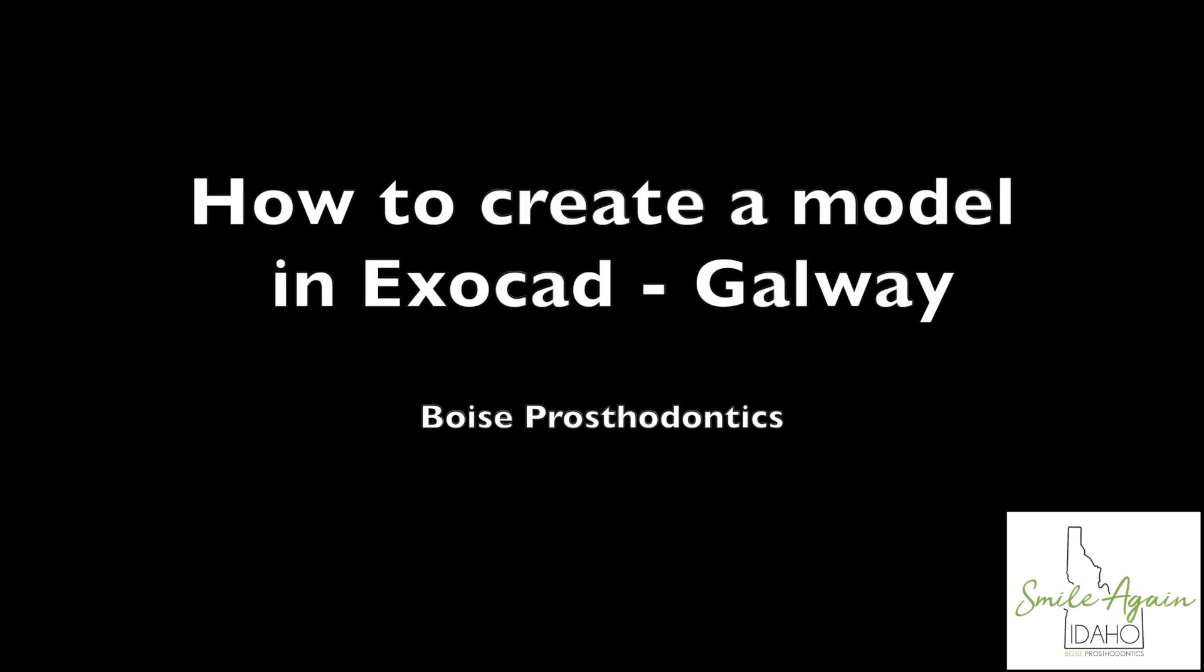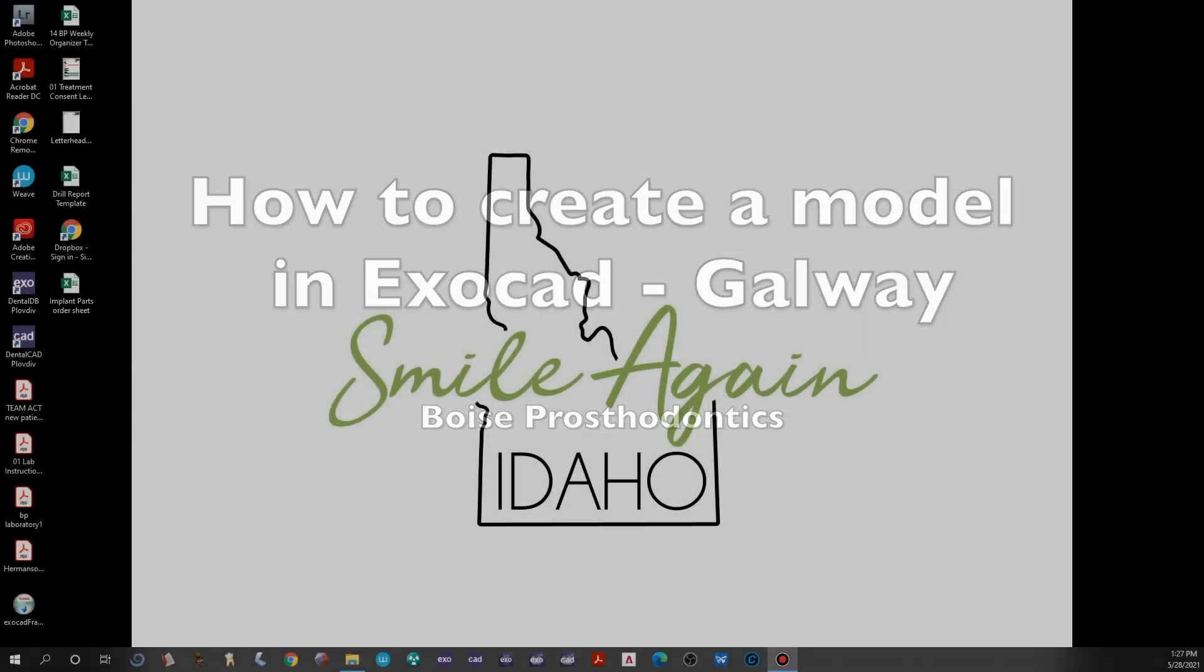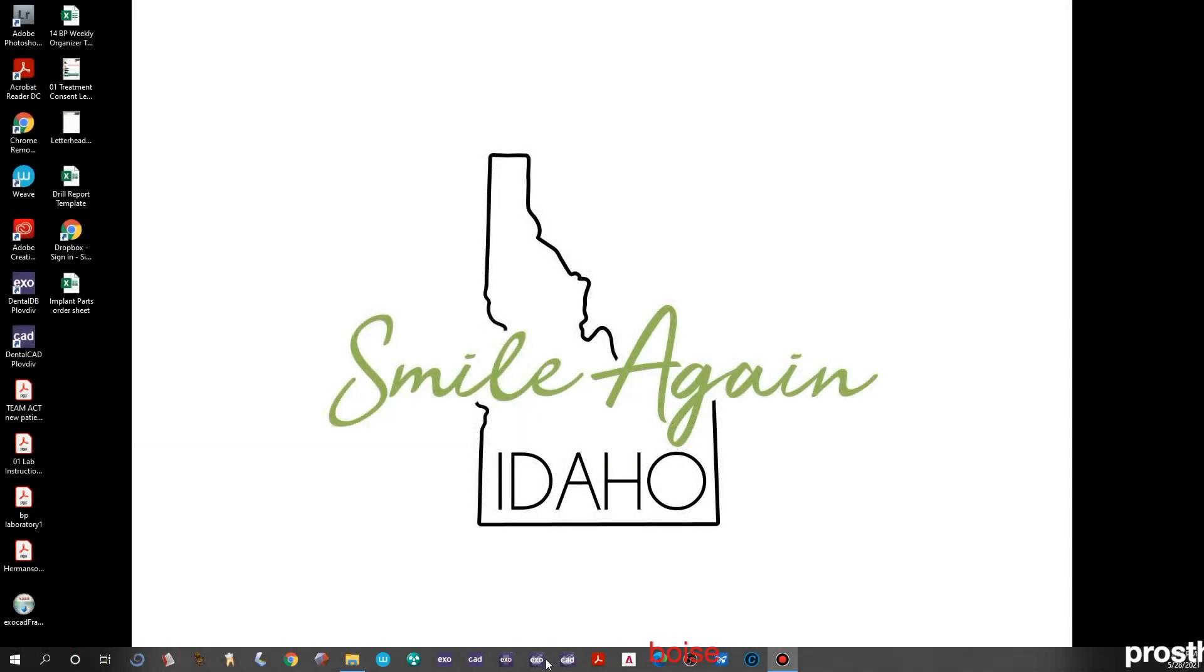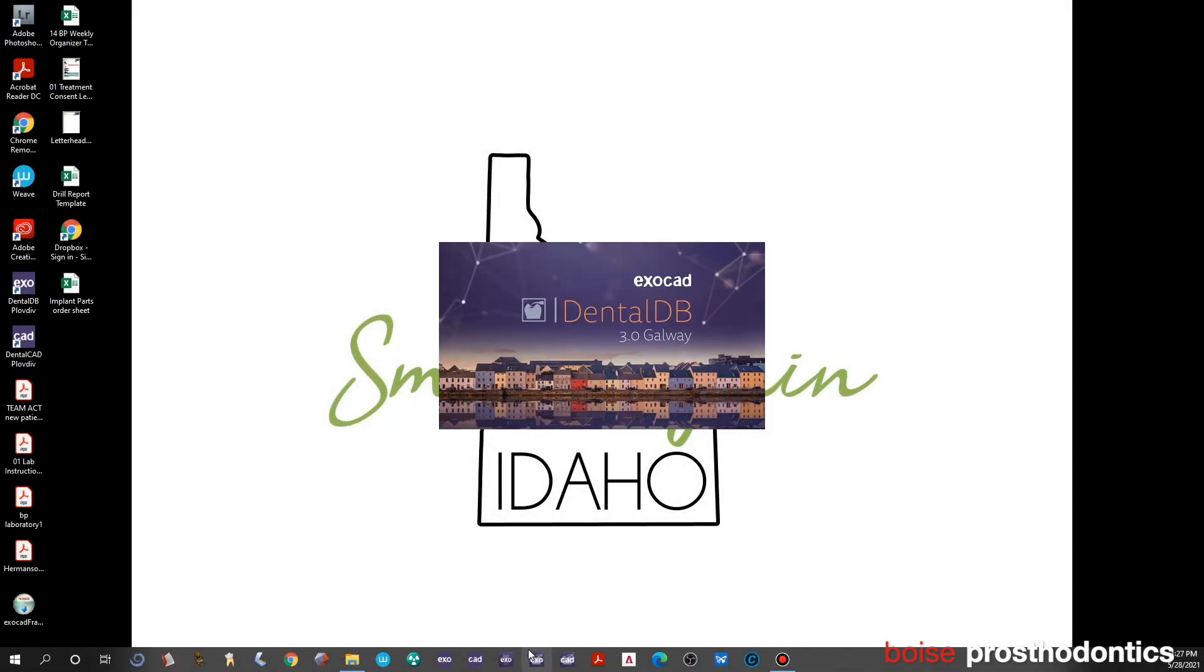This video is designed to demonstrate how to make models using STL files in Exocad Galway 3.0.